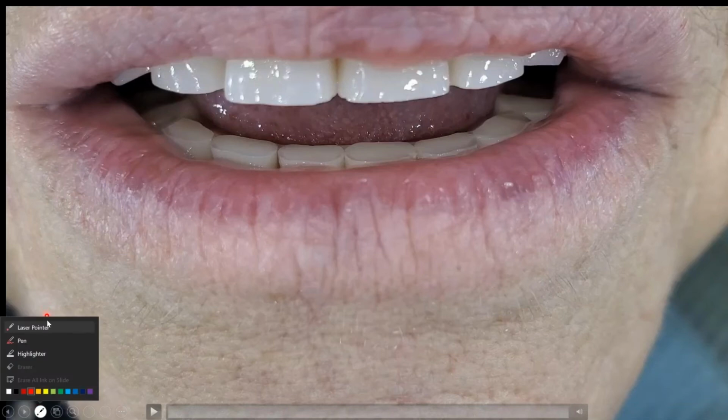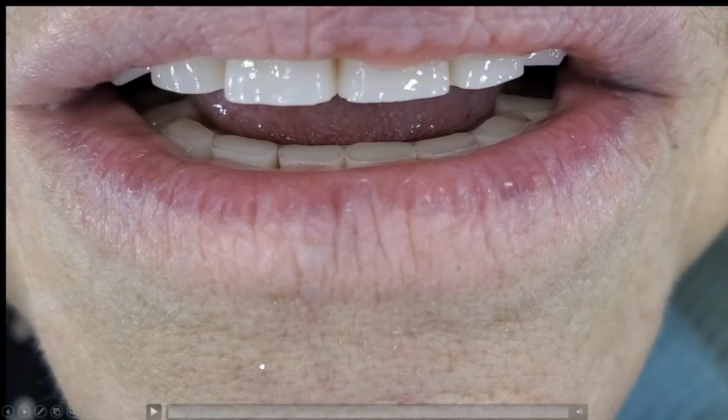Okay. Now, what am I going to do? Well, I'm going to open the vertical because I'm supposed to, and I'm saying that in my funny voice. And I'm going to give her teeth with tread wear on it again, and now expect she's not going to have a problem. Because watch her talk.